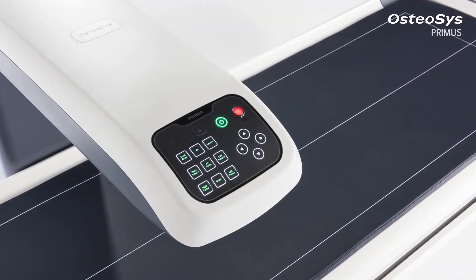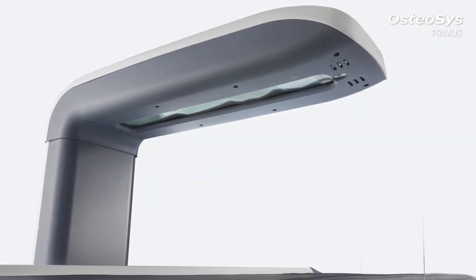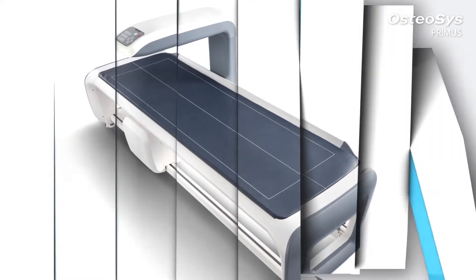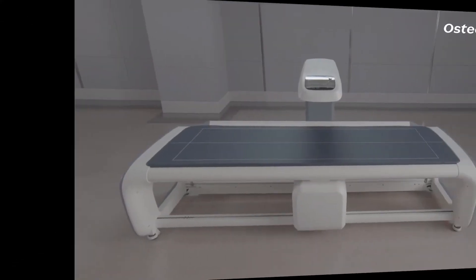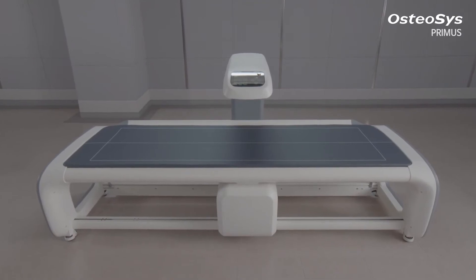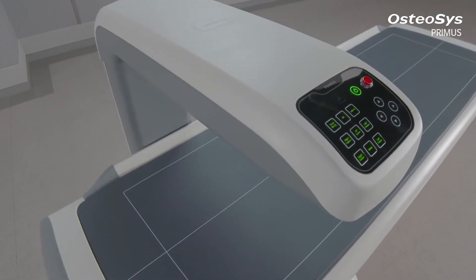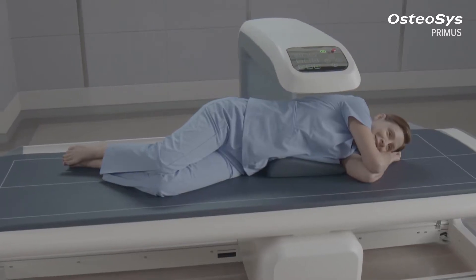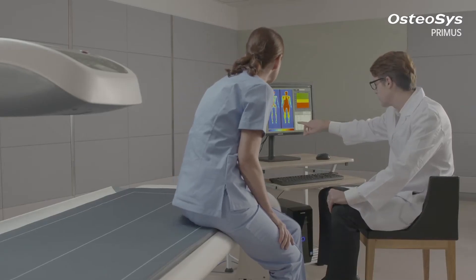Primus is a whole body analyzer for BMD and body composition, scanning the whole body or a specific area of the body with its cutting-edge dual X-ray absorptiometry technology. Primus quantitatively analyzes the BMD, lean mass, and fat mass. You can help your patients keep their whole body balanced and maintain a healthier life by following the process of continuing diagnosis and management.